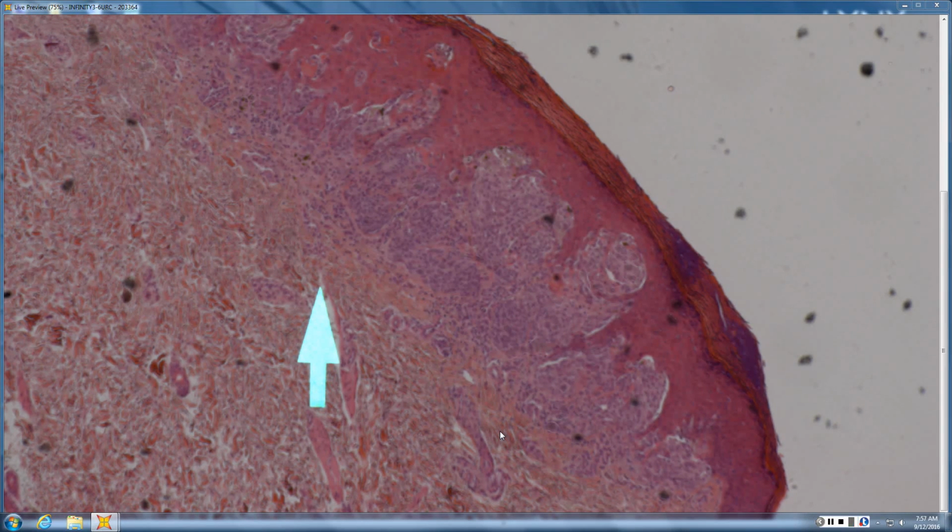People have done studies where you look at these cases you agonized over, and if you just draw a rough triangle around the outline, you categorize 90% of them correctly just by which way your triangle points. If your triangle points up, it's a melanoma. If your triangle points down, it's a Spitz nevus. So these are basic things that are helpful in the majority of cases. You look at it and say, it looks like a Spitz, and a more experienced person says, that ain't a Spitz. What are they looking at? They're just looking at which way the triangle is pointing, whether it is dispersing at the base, and whether the nests are vertically raining down or not.